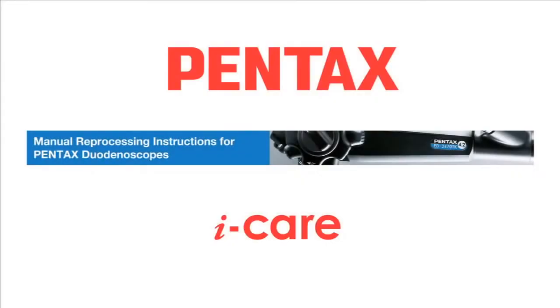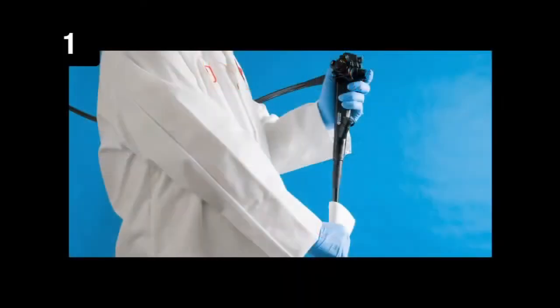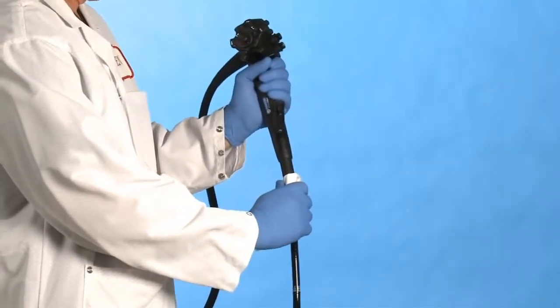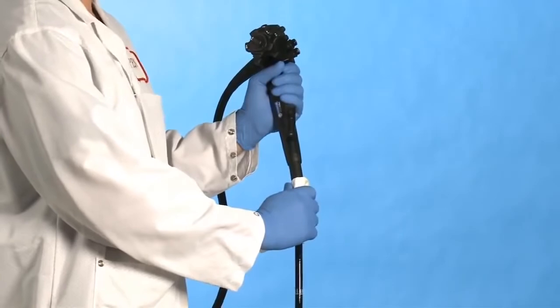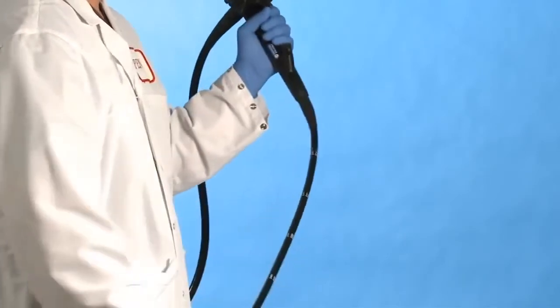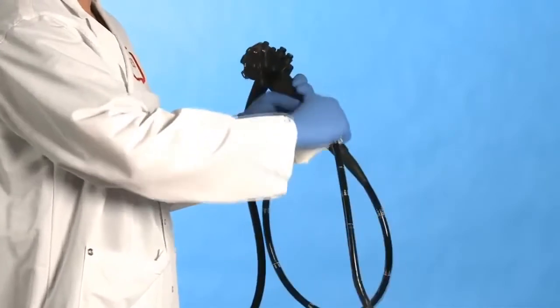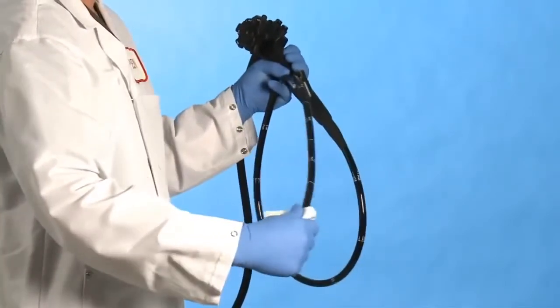Manual Reprocessing Instructions for Pentax Video Duodenoscopes. Step 1: Wipe the Insertion Tube. Immediately after the procedure, with the endoscope still connected to the processor, wipe the insertion tube with a lint-free cloth saturated with enzymatic solution that has been diluted in accordance with the manufacturer's instructions.